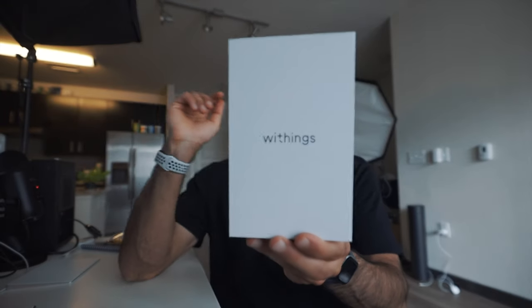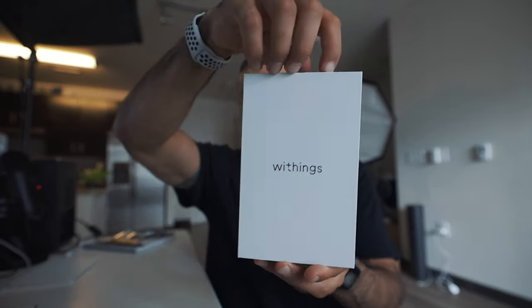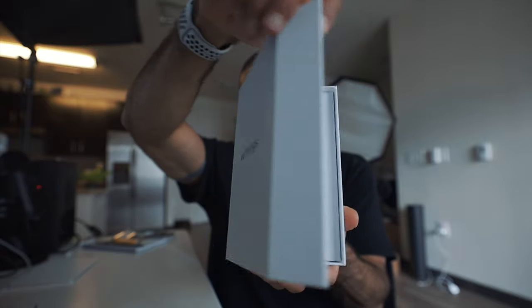This is the box right here. Pretty simple. Pretty standard. White. Clean. Got the Withings logo. And then as soon as you open it up, it's got magnets over here.